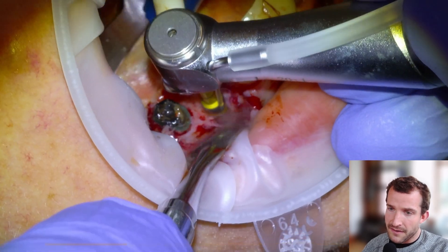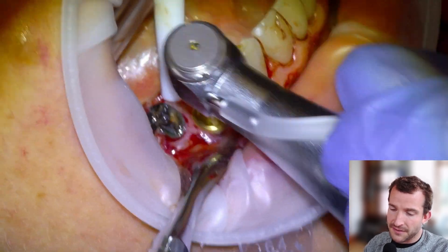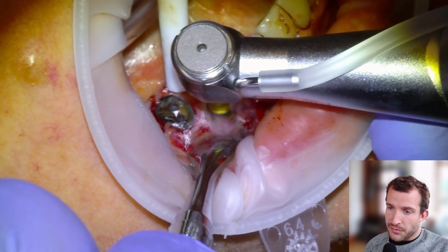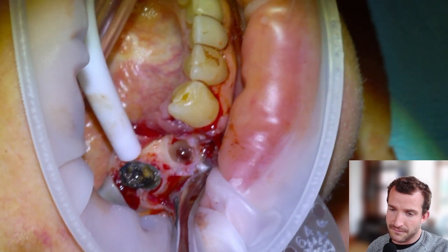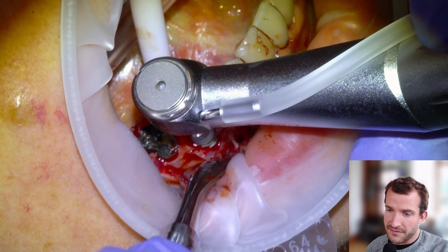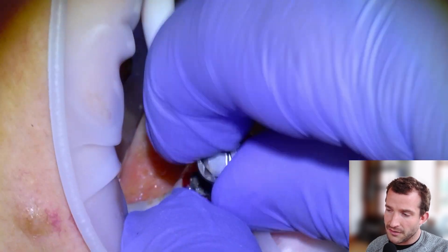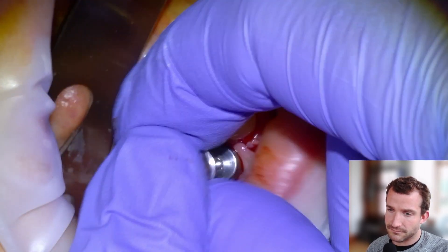So we're going to work our way up to a 4.5, and then we're also going to do a little bit of bone profiling so that the rim of the bone is flat circumferentially, so there aren't any high areas when we go to place the implant. Here's our 4.5 — going to run it nice and slow to finish opening it up. Usually with mandibular bone I'll take it down a little bit deeper because of the taper of the burr — if the mandibular bone is very dense, you can sometimes end up with too much torque. Pretty good insertion torque here. So we're just going to take it down the rest of the way until our polished collar is buried just enough that we can get our healing cap around the wider part.